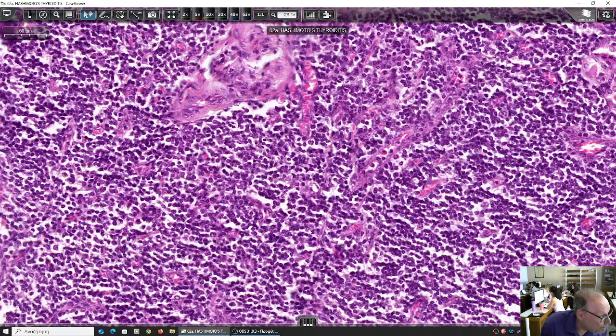Which ones are they? Excellent. The natural killer cells.